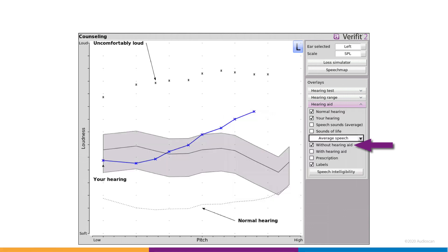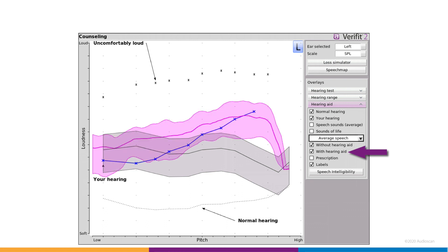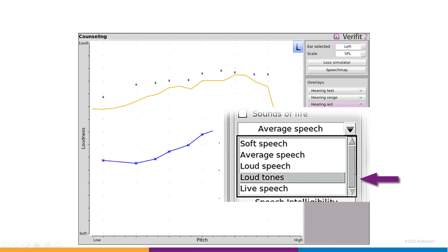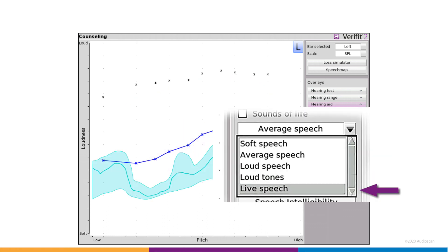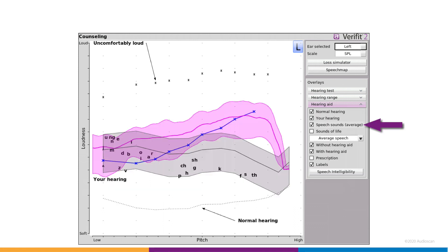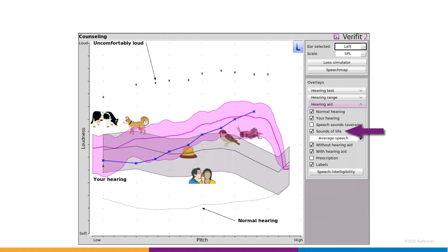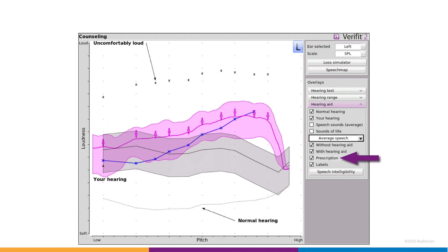If previous measured data is in speech map, the aided spectra can also be shown. In cases where MPO or live speech tests have been run, these will also show up in this selector. The familiar speech and sounds of life overlays are available, as well as a prescription toggle in case it's desired to show the prescriptive targets.